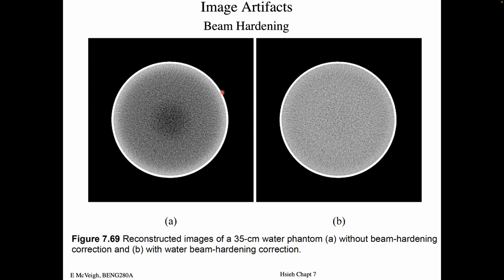And also when a projection this way, it has lower energy X-rays. And so it looks like it attenuates X-rays better out here than here. And the reason these look like they're attenuating better is they're attenuating different X-rays. Their average energy is lower than the X-rays being attenuated by these pixels.